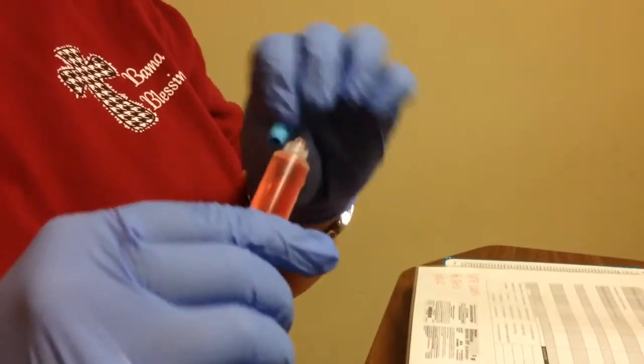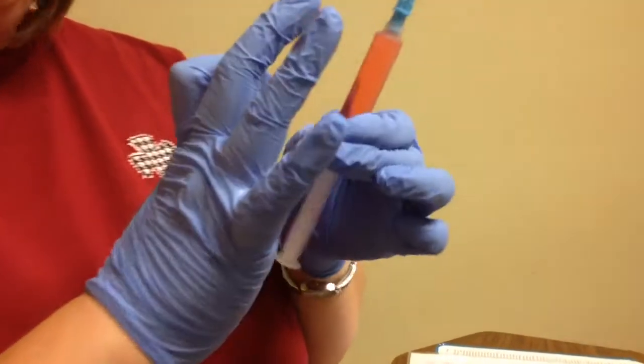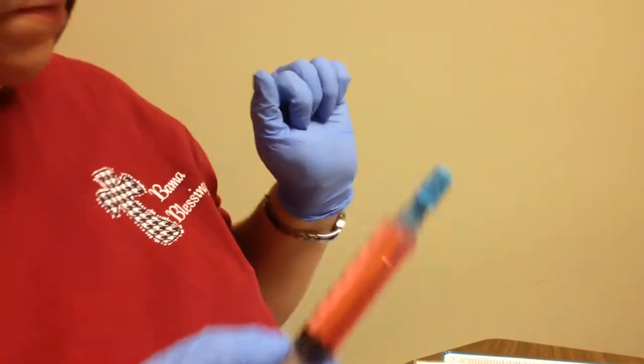Now I've diluted it with saline, and I'm just going to push my air out of it, okay? I'm going to take my cap, make sure I keep this end sterile and this end sterile, and recap that. I'm going to label this with the name of the med, the dose, and the patient's name so that I know when we go in what we've got.